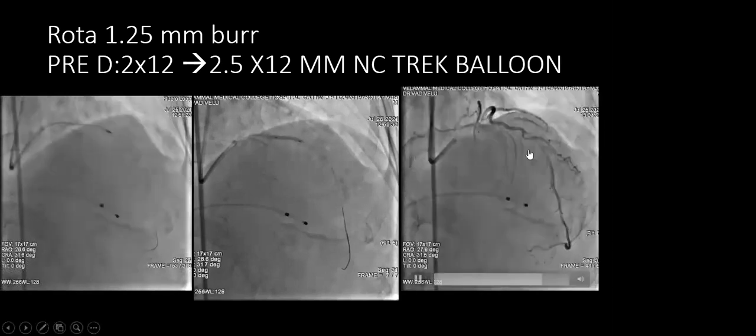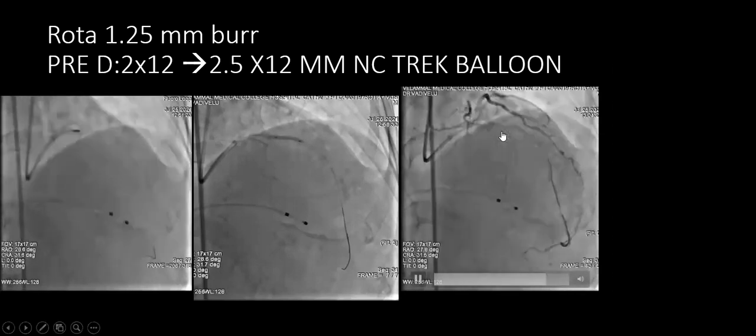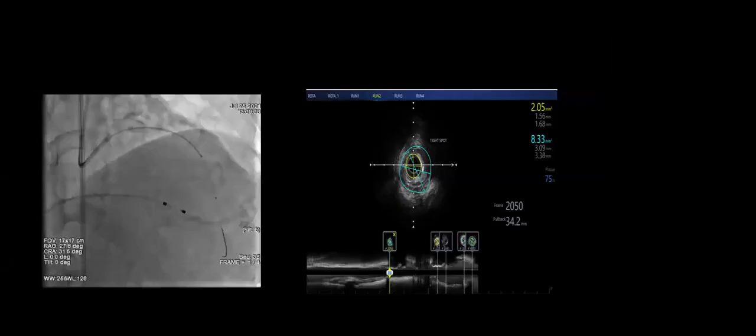So the lesion preparation, this was the angiographic picture. And you can see the IVUS, the tightest spot showed an MLA of 2 mm square. As we know, it's very, very significant tight disease. But you can see there are fractures that can be noticed in the longitudinal section.